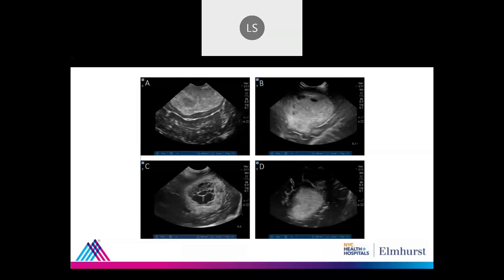Another metastasis? Maybe. So it's kind of homogeneous. It's kind of feathery, maybe, at the edges. More like a primary sort of. What kind of looks like a homogeneously enhancing sort of feathery lesion, say, on a contrast MRI? I don't know if that's what this is, but that'd be my next guess as to what this is.